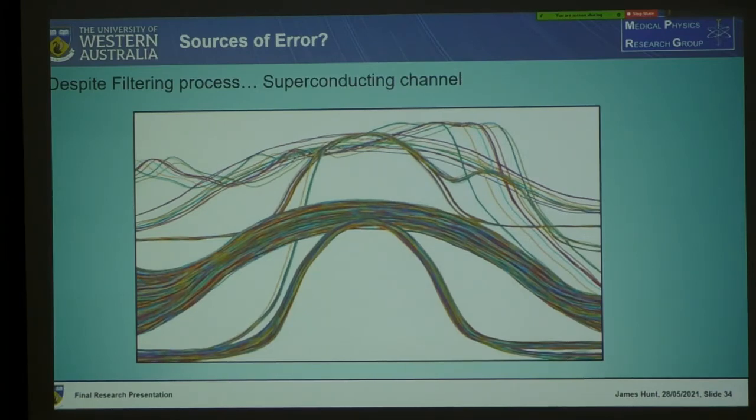One of the methods I tried to eliminate its interference was to set a limit on the difference between the left and the right values, if that makes sense, expecting a bit of symmetry, but there's a bit of interference here. But as you can see, there's a lot of circles here and not so many lines there, so hopefully it didn't interfere too much.